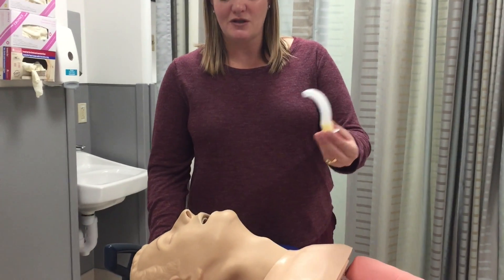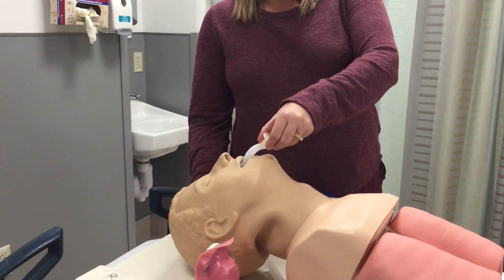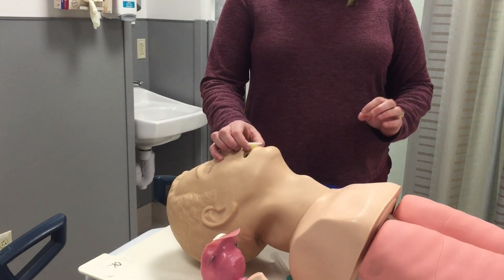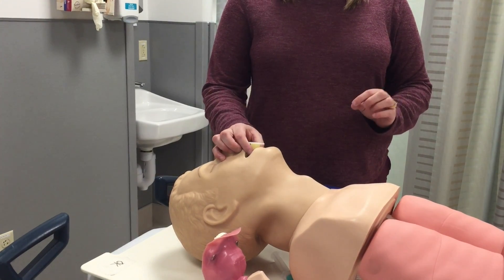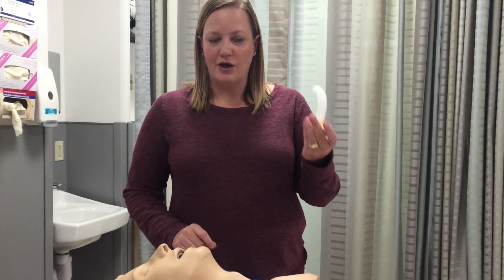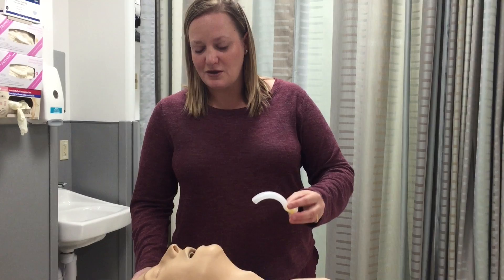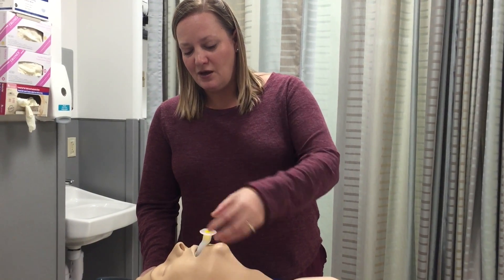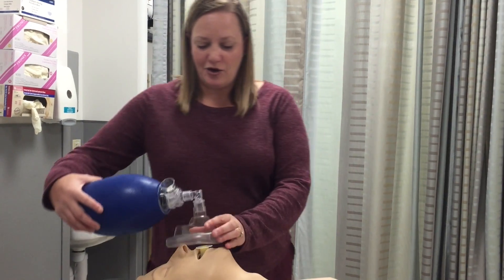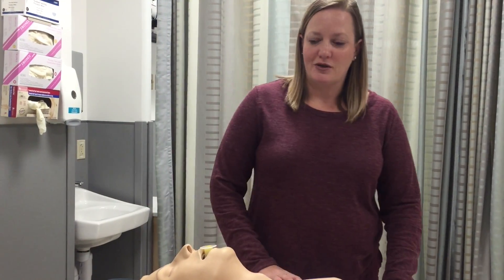Basically, you place the patient in sniffing position and you place it in the mouth all the way till the end. The main thing you need to make sure of is that you're not pushing the tongue back when you place the oral airway in. So again, you push the patient in sniffing position and you place the plastic oral airway there. And that way, when you bag your patient or you have oxygen on your patient, their airway is more open.